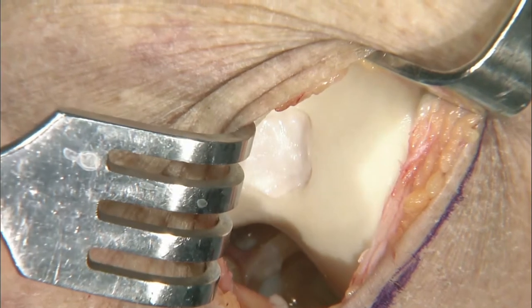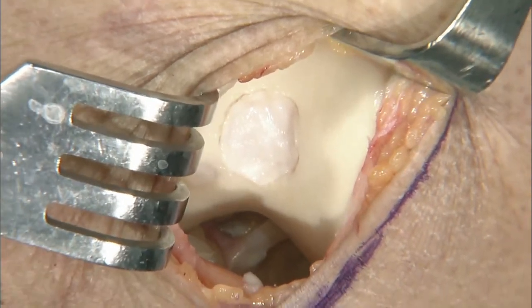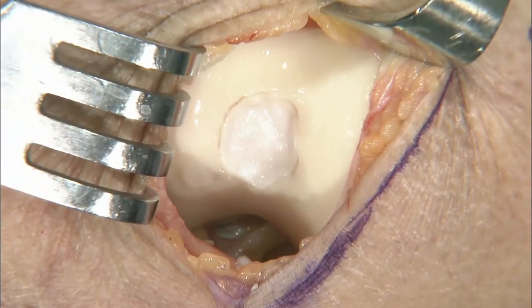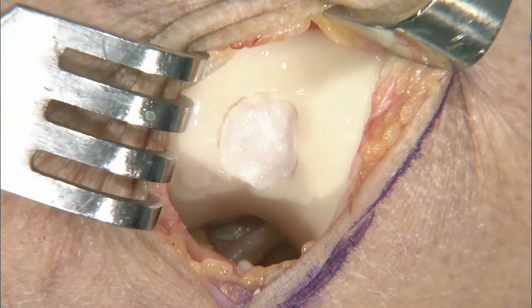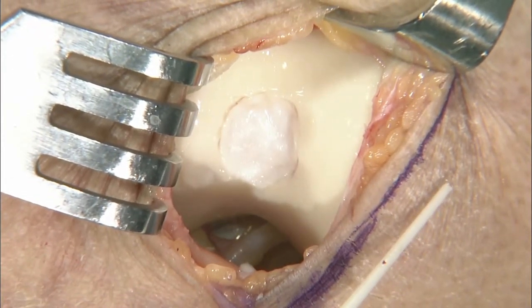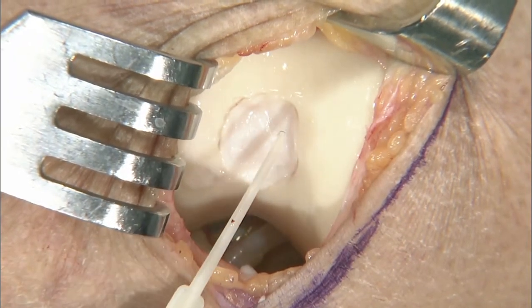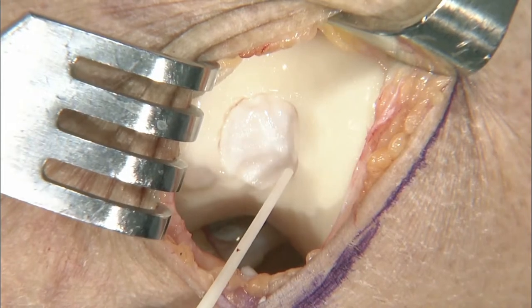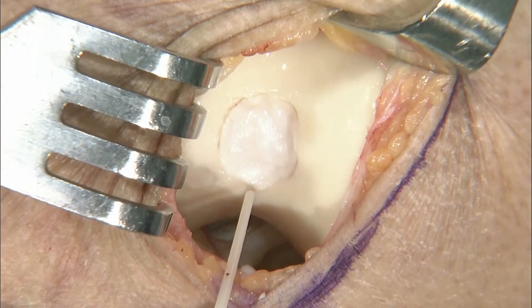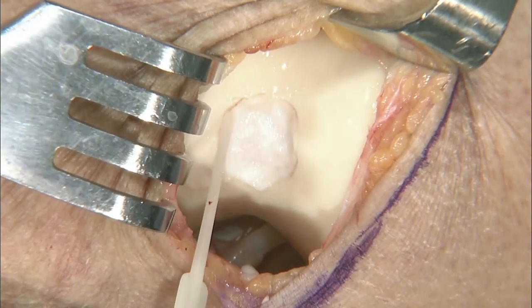Now, like Adam was saying, one thing that you can do, especially in defects where you feel like, boy, I want to get a little bit more on there. Again, I urge you, I'm an over-fibrin gluer as well, but this is more of a minimal thing than anything else. You're going to take your fibrin glue, get that feel for how you play with it, really get a little bit of a bubble at the top, and then you're just going to put it right around the edge. Just getting little bubbles of it, not really trying to inject it. Again, little bubbles all the way around the edge of it so that it's coming out.